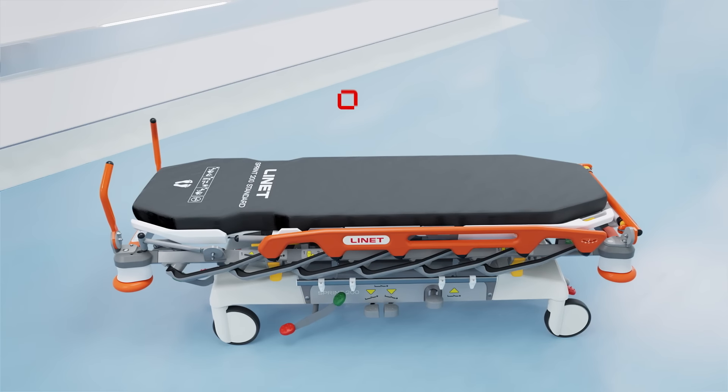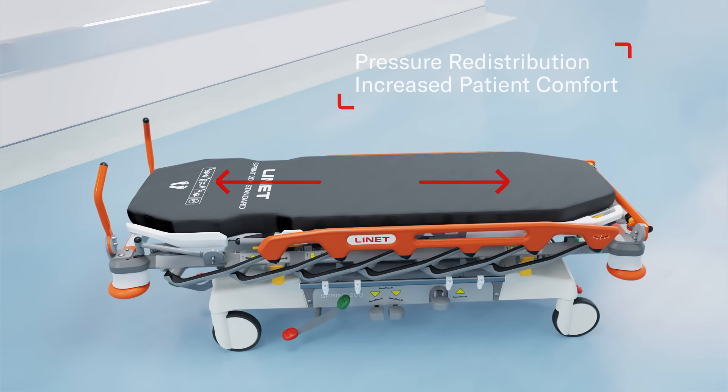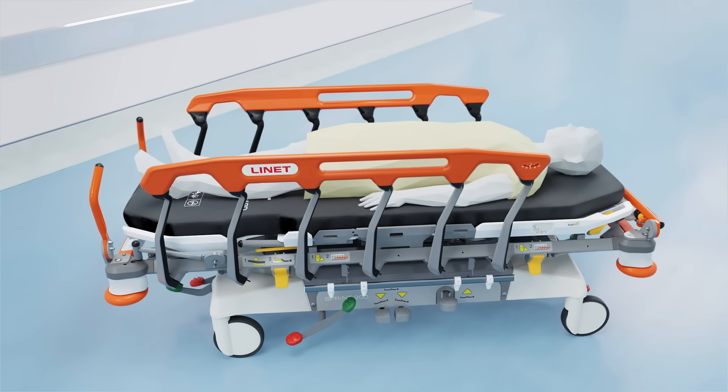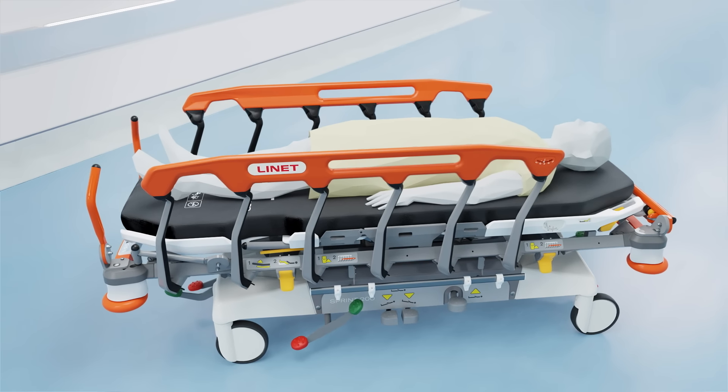The stretcher offers a variety of mattresses to address every need. The advanced option provides increased comfort even for longer stays, while the reactive mattress helps with pressure redistribution on contact points.